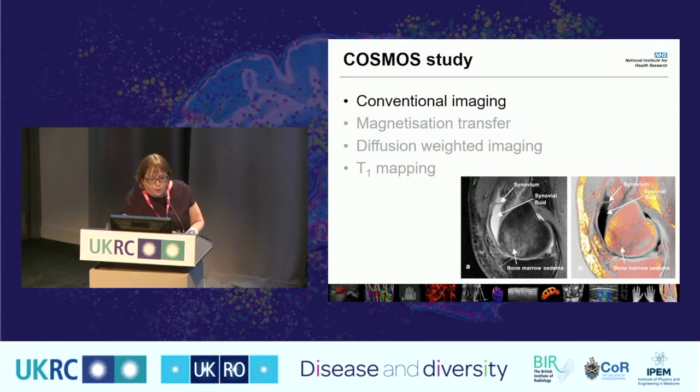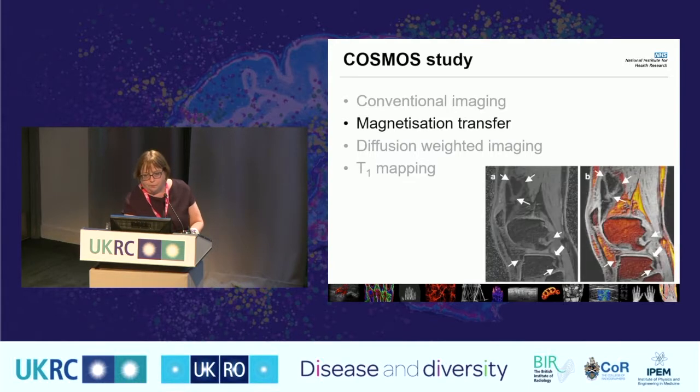This image over here is actually a proton density image, which we've inverted and put on the fat images from a Dixon VIBE. A Dixon VIBE is a way that we can look at MRI where we get water, fat, combined imaging, and we get different sequences, and one of those sequences is a true fat image. By adding a true fat image to a conventional image, all of a sudden we can see the fat planes that are happening here so that the synovium is a little bit clearer than it is in this image. It was really cool and very sensitive for looking at meniscal tears, but it really didn't answer all the problems that I wanted to address.